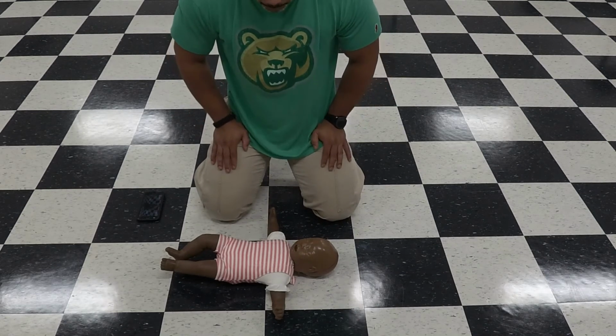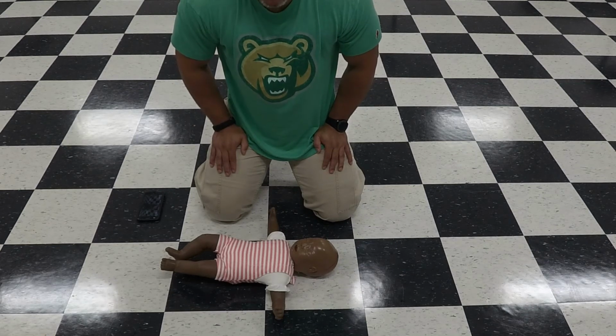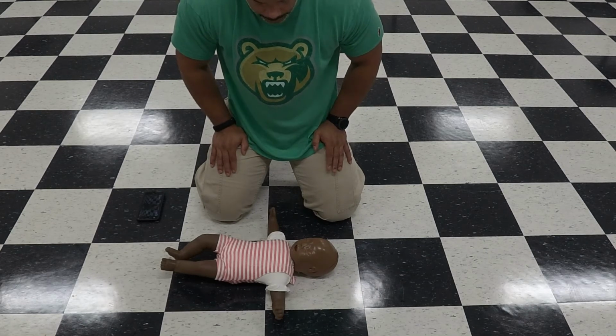The process for both child and infant are much the same as with an adult, with the exception of the rescue breaths.